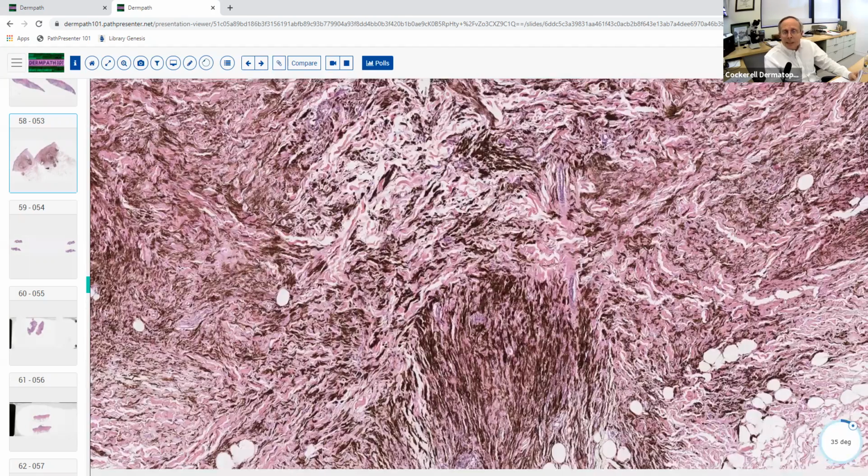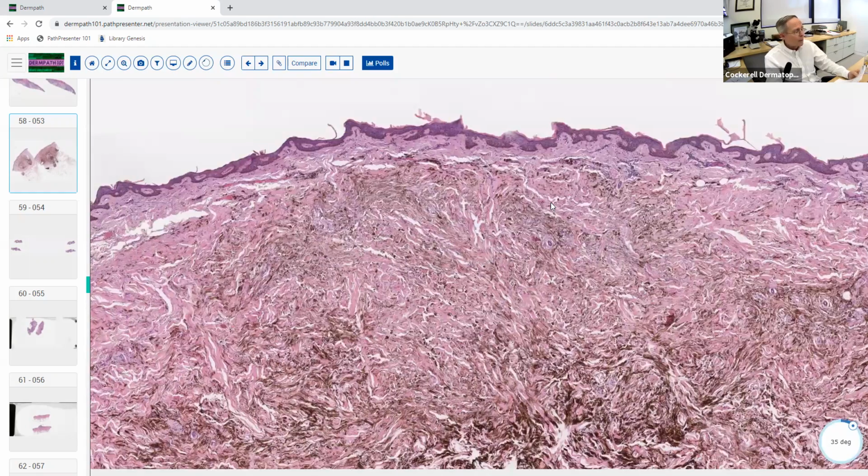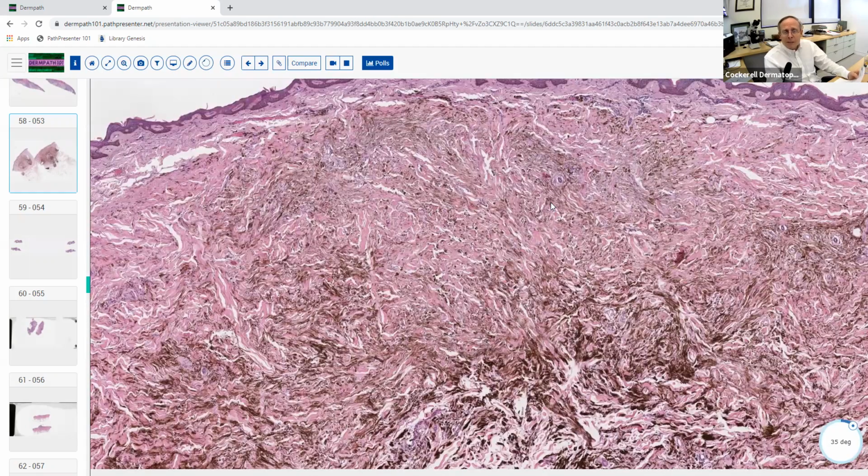We favor benign. So we're going to throw that one out. It doesn't have criteria for melanoma. Recurrent dermal Spitz nevus. Is there a scar? No. Do Spitz nevi generally tend to give you this heavy pigmentation? Rare. There's some forms that can, but most of them don't. And they don't generally penetrate this deep down into the subcutaneous fat.